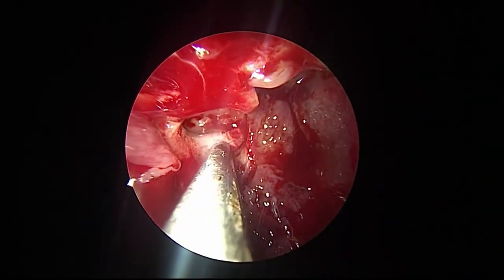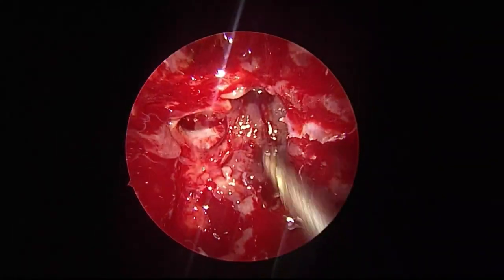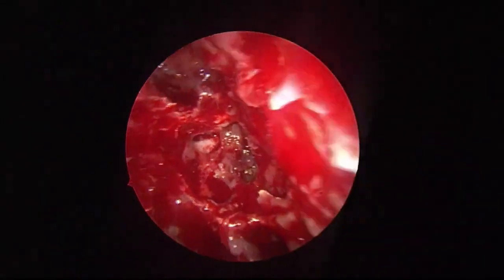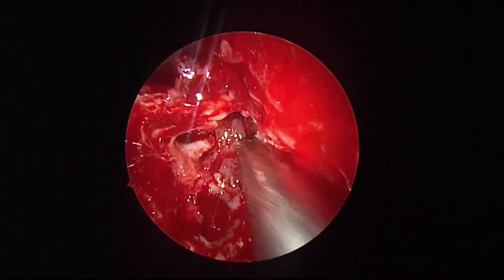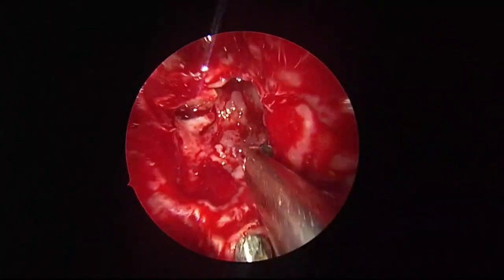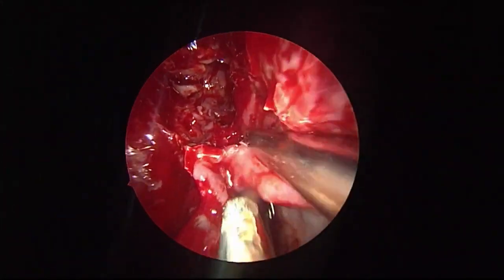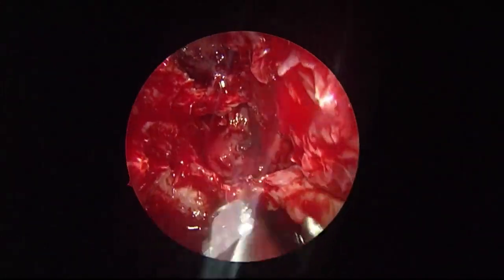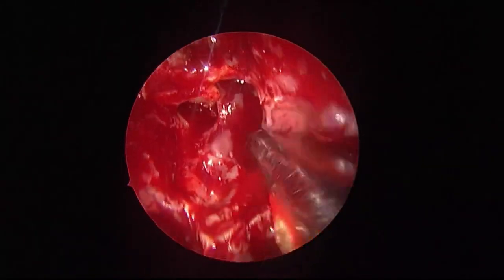This optic nerve is dehiscent and this is the ONOD cell. This is the postethmoidal cell which has gone beyond the sphenoid. This is the sphenoid planum; it has gone beyond the sphenoid. This is an amazing example of this safer medial approach. Identify the sphenoid. Now I have done my postethmoidectomy. When? After identifying the sphenoid ostium. Never do it before. You never know which case has an ONOD situation.